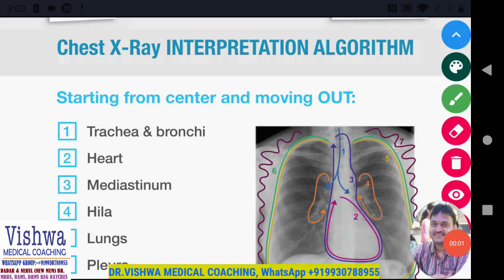Interpret an X-ray chest, I can say. Now, we have a couple of lecture series in our application, through which we're going to learn very easily about all the types of X-rays. Also, there are a lot of videos available on YouTube where we can understand how to interpret X-rays.